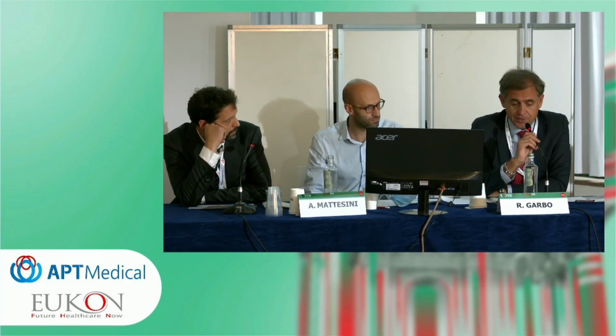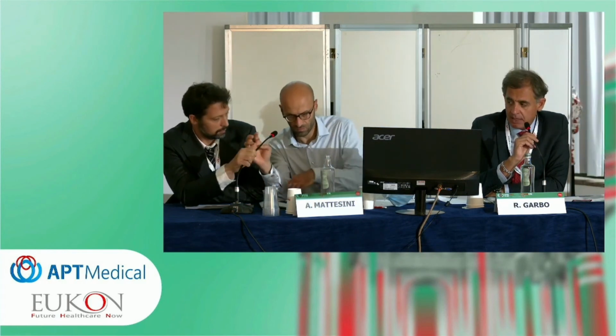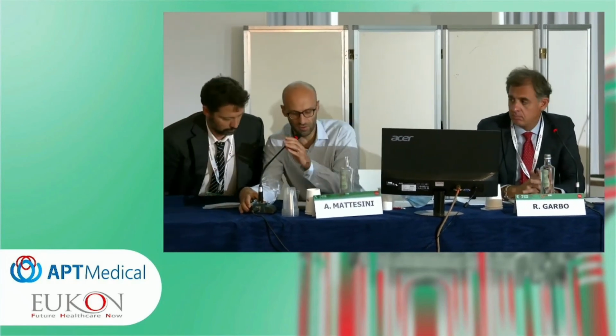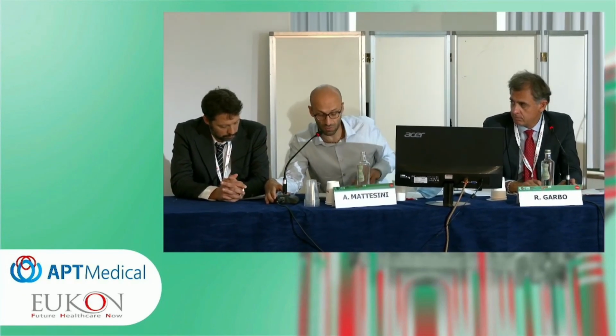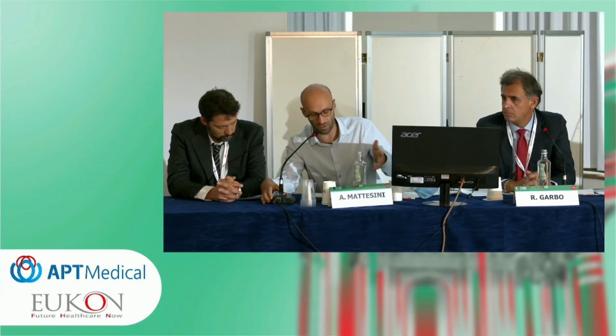So we have a question from the website about your spheric balloon. They're asking if it's useful also for pre-dilatation, like a normal non-compliant balloon, or useful only for instant post-dilatation? In my opinion, the main topic for this balloon is post-dilatation, when you have to re-enter a stent, sometimes with minimal malapposition, and you get stuck with a non-compliant balloon, and this one is crossing.